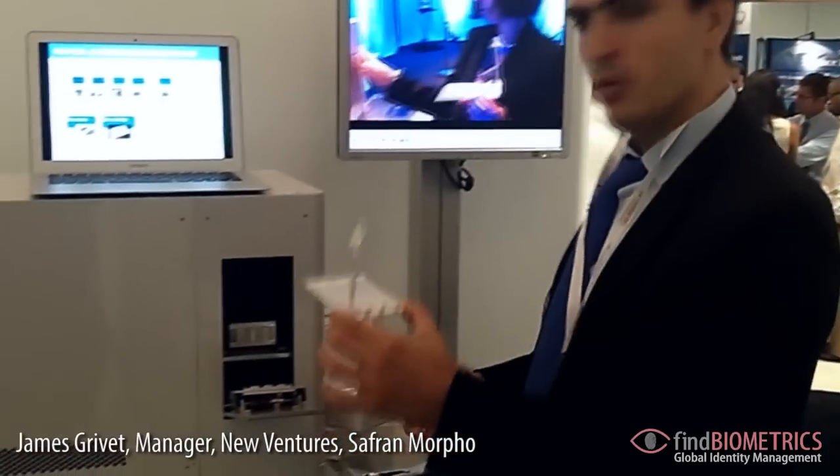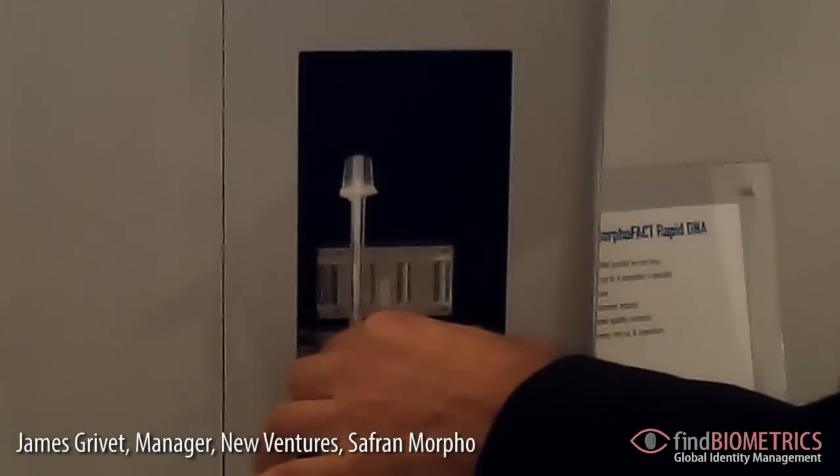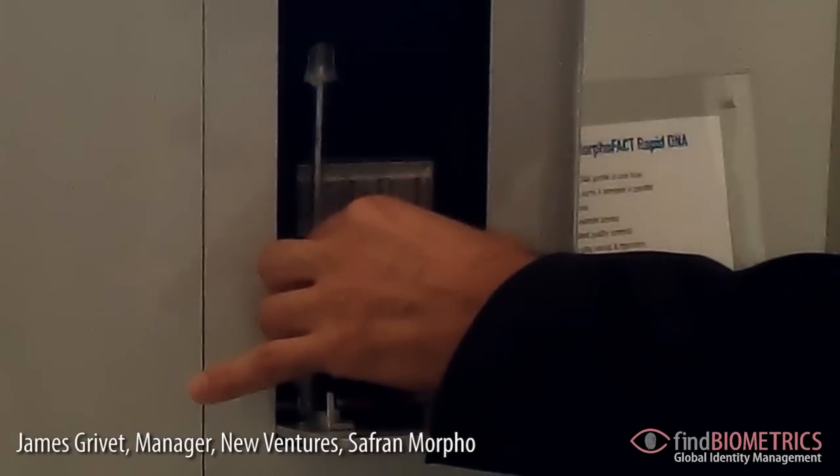Only one move — it's a very simple process. You then take the cartridge and slip it into the system, like this.